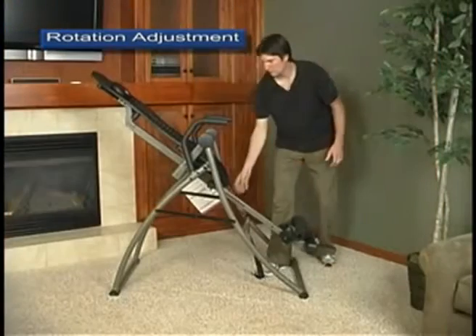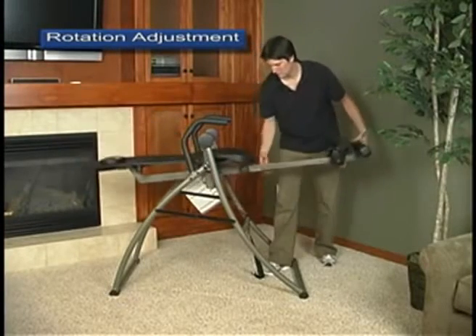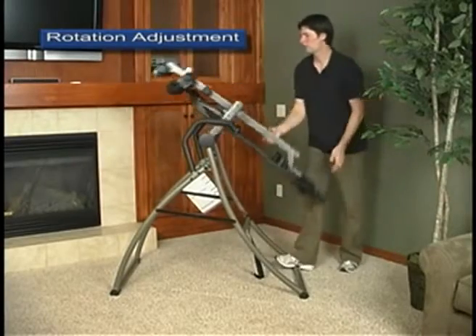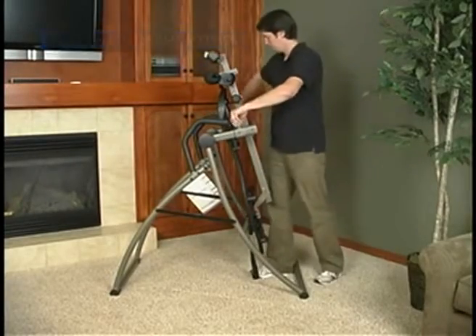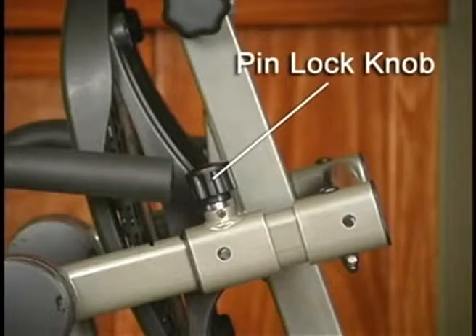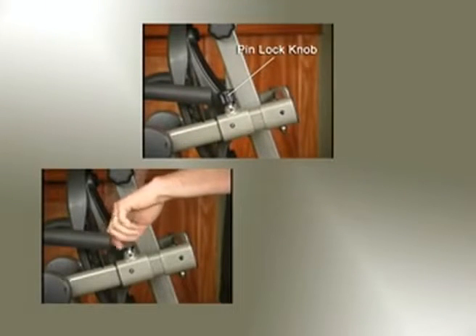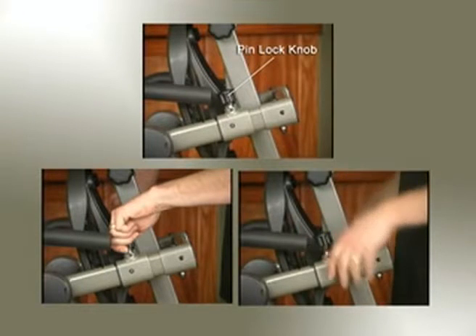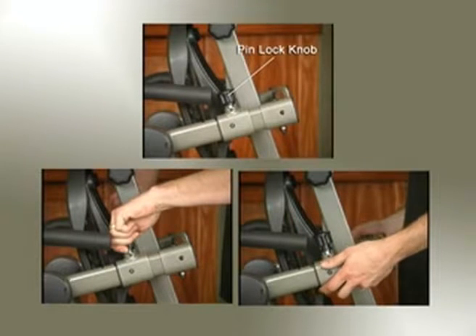The easiest way to adjust the rotation adjustment arms is to shorten the main shaft and rotate the table bed opposite from use into its storage position. The pinlock knobs serve two functions: as a derattler to prevent excess movement of the support arms, and as a spring-loaded pinlock to engage the rotation adjustment setting.